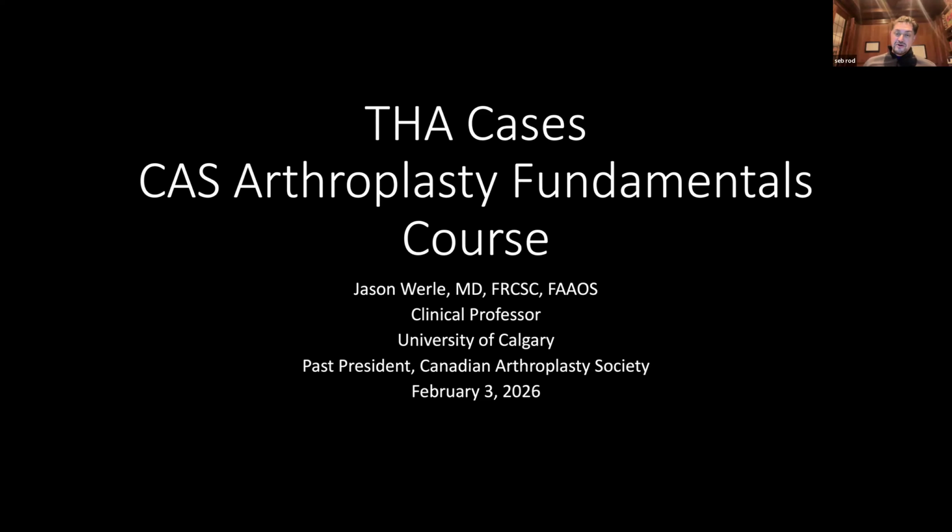I disagree. I'd actually think it's more important even in knees than in hips, because I agree with everything you said about hips. But with knees, until you use a robot in a knee replacement, you don't realize how you can change that component position and how much it affects range of motion, and how much distalization of the femur versus a little varus on the tibia or slope. You don't even understand what you don't know until you see the robot, and then you have a whole new appreciation. And those alignment strategies that you talked about, you can't do half of them unless you have additional technologies.